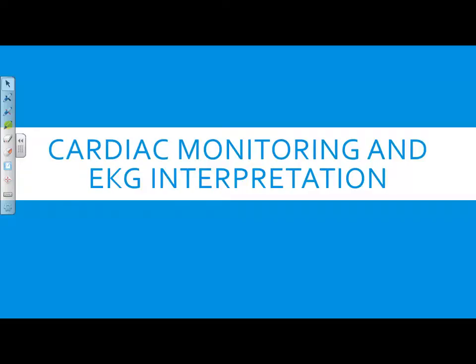All right? But that goes across all of your diagnostic tools. So in this class, we will mainly focus on the cardiac monitor. With airway, we will mainly focus on capnography, end-tidal CO2, and SpO2. When we treat a patient with diabetes, our diagnostic tool is the glucometer, all right? Those are just diagnostic tools. We have to do a good assessment on our patient in order to know exactly how we're going to treat them.